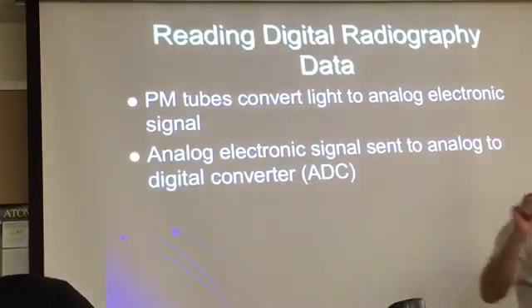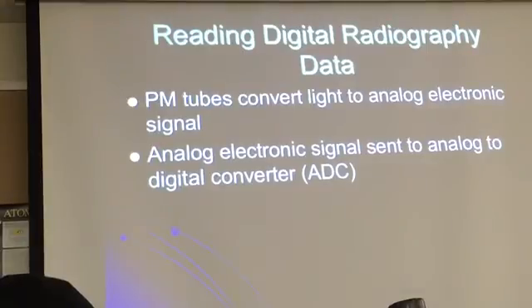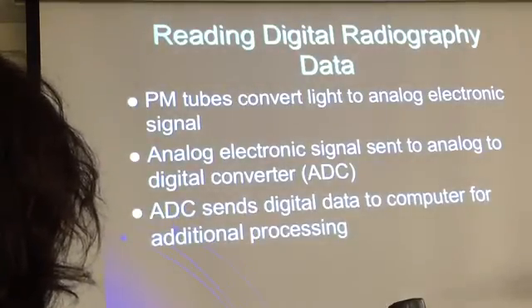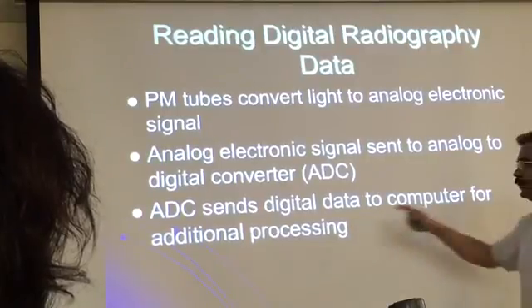An ADC. Remember, an analog signal is a continuous signal. It's non-stop. There are no breaks. It's just one full single signal. So you send this signal to the ADC, and the ADC sends the signal to a computer for additional processing.